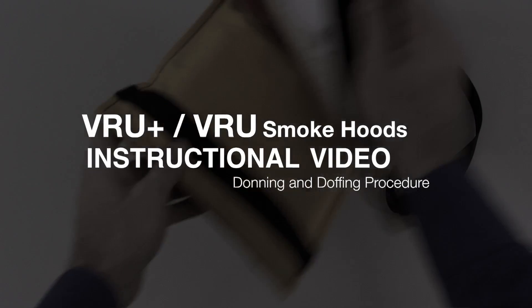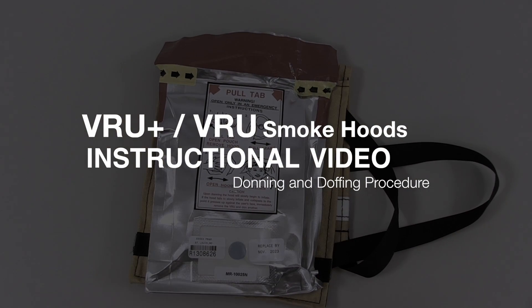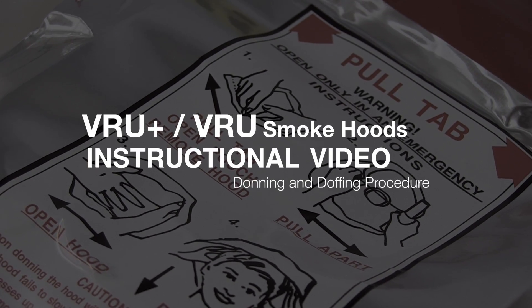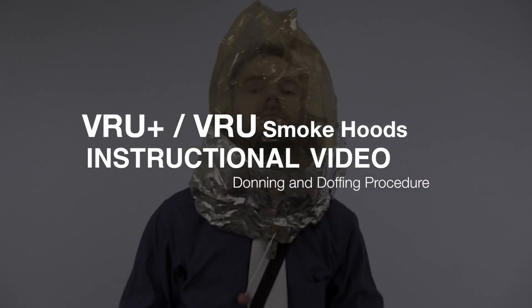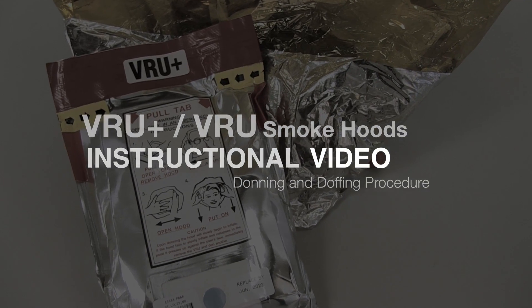VRU Plus smoke hoods are portable breathing devices which can be donned in 15 seconds or less in the event of an emergency. The VRU Plus can save your life or the life of the person you are rescuing by providing precious extra minutes to safely escape the hazard. The procedures in this video also apply to the VRU.